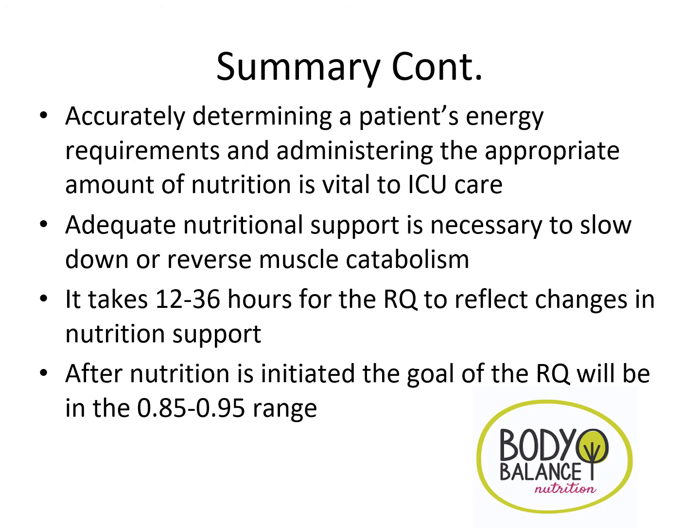So there are guidelines that the AARC has put out. AARC practice guidelines can be found on page 176 in Pilbeam's for indirect calorimetry. And then there are also practice guidelines in our textbook on page 173 for transcutaneous monitoring, and I know that was addressed in our last PowerPoint. So make sure you're looking at your textbook.